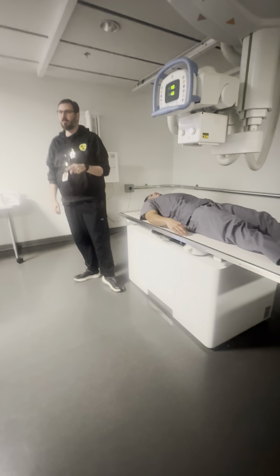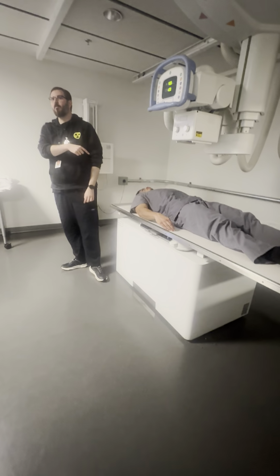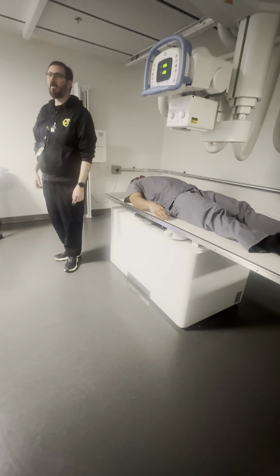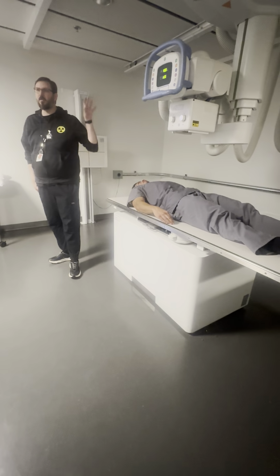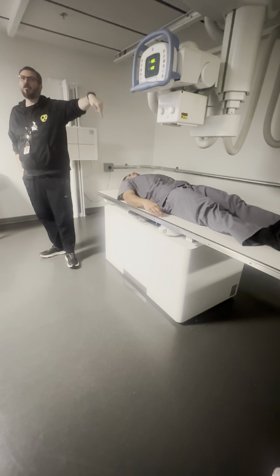I see. The reason that's not good practice is, if they're going to have a reaction to the contrast, I want them to have it with me where I can watch them do it. Because if I go upstairs and give it to them and walk away and no nurse rounds on them for like 30 minutes, they could already have died and aspirated in the room. So in our facility, we give contrast in our visual range.